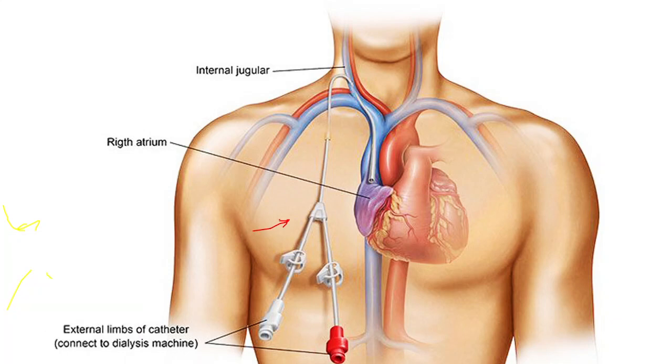And this is how the catheter appears. So probably exit site here, entry site here. Regarding the exact site, where to keep the exit site, how to measure it, and all, we will see in a separate technical video. Here I am answering just simple common clinical questions.